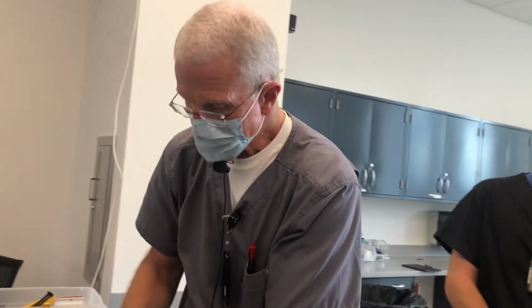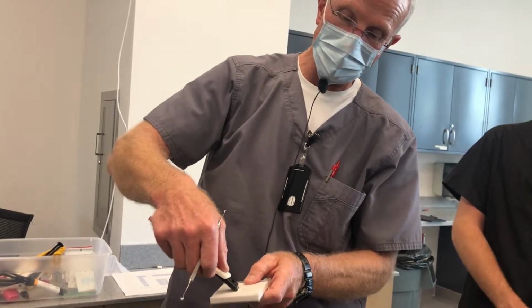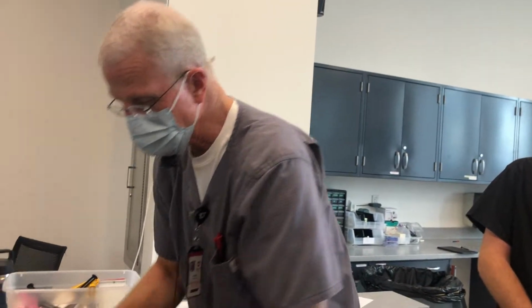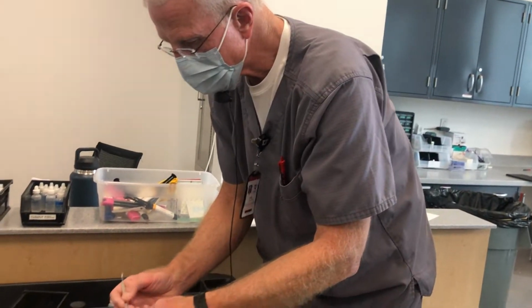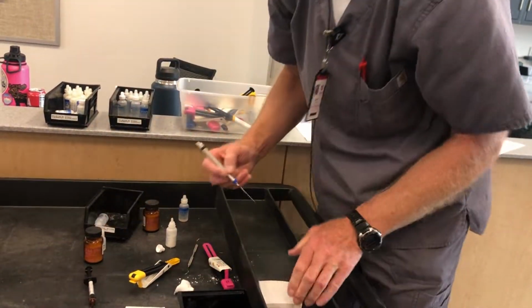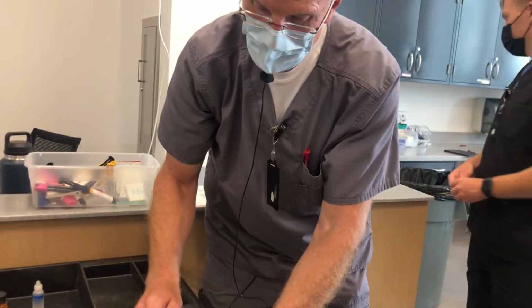Yeah, it's not that bad, but you can see, I mean, they do go past their date, and it should be equal amounts of that. Make sure you put the clicker back on right away. And if somebody wants to, again, it's going to be too thick, but you're welcome to experiment with that. Now, let me just show you on the mixing. Let me show you one, and then I'm going to have you do one.